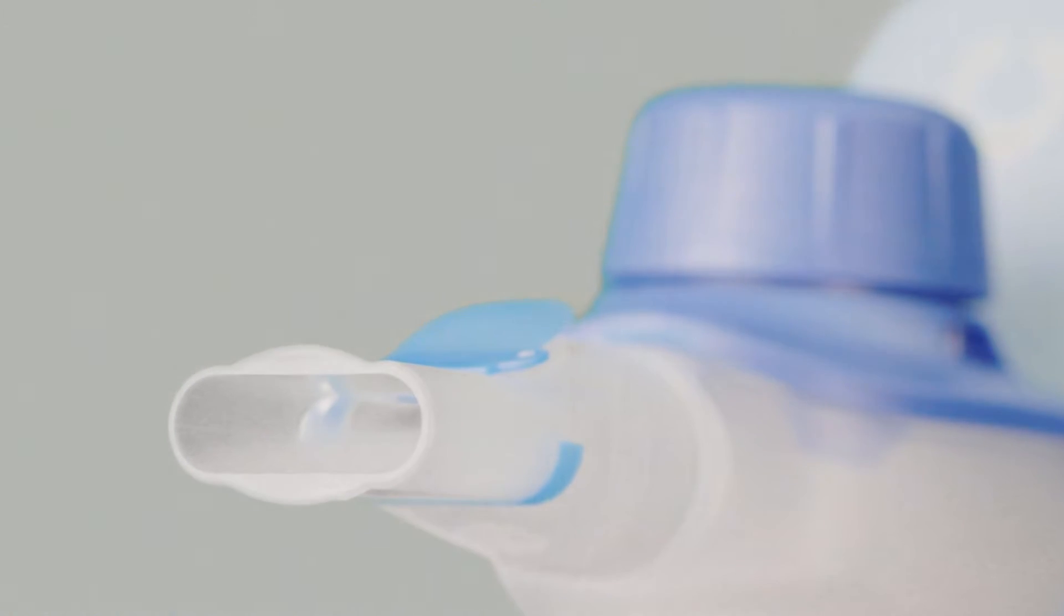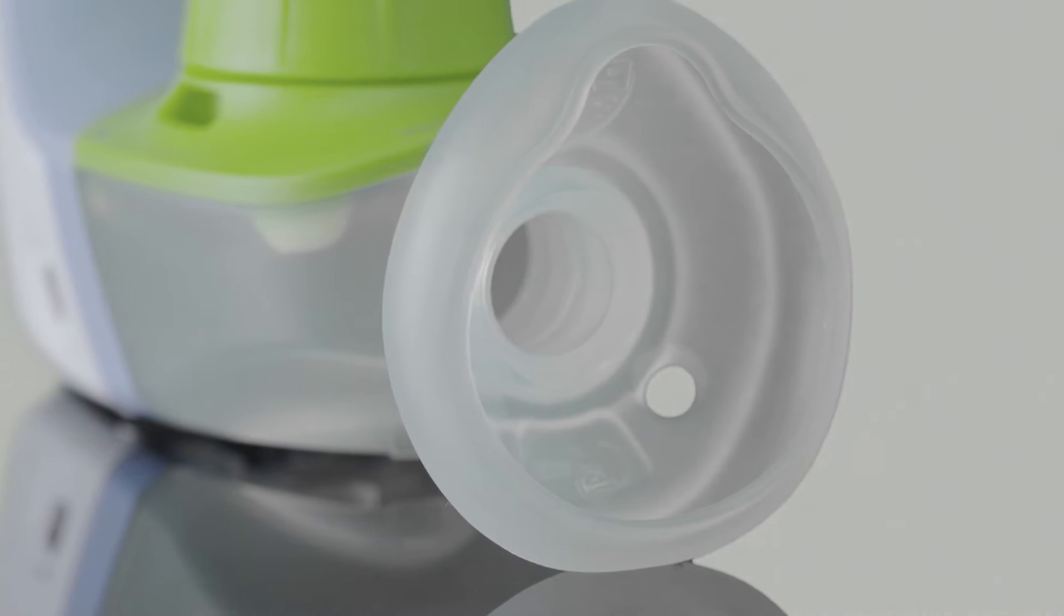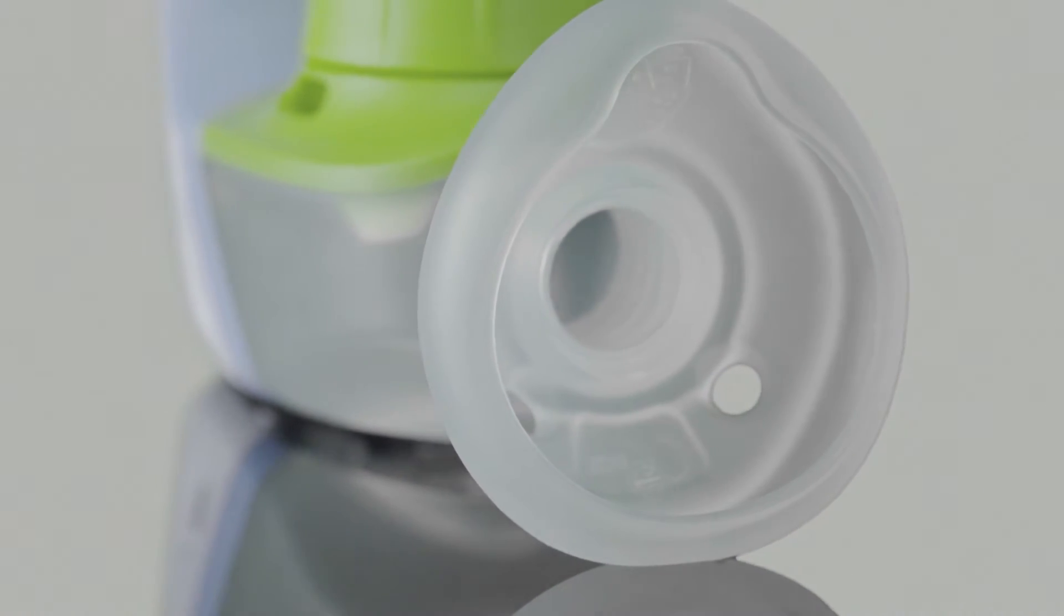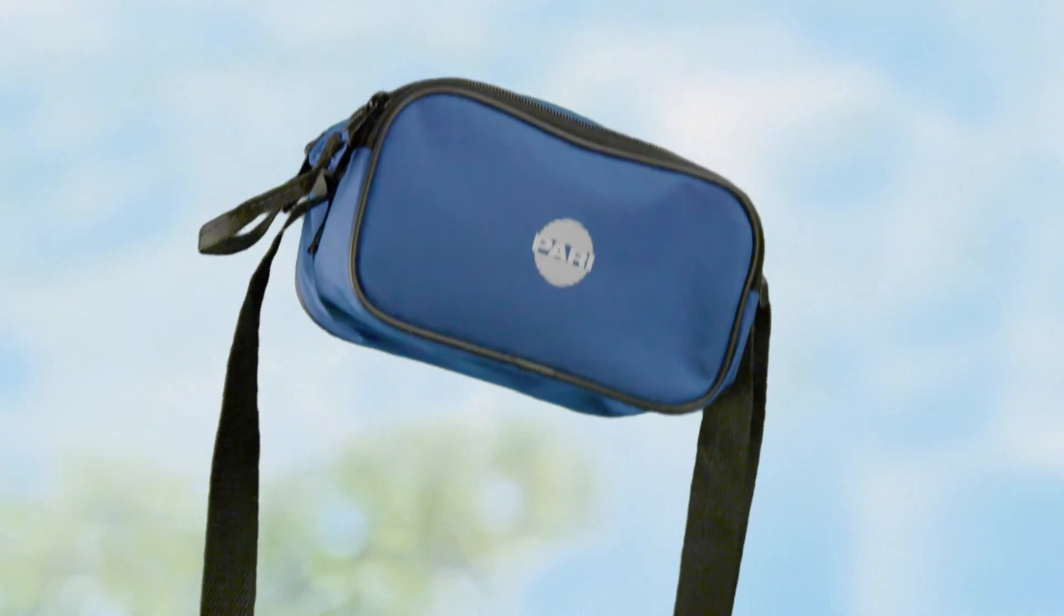Velox with a mouthpiece for adults and children from 3 years of age. Velox Junior with a mouthpiece and soft baby mask for babies and small children up to 3 years of age. Both devices come with a practical bag for safe and hygienic storage.